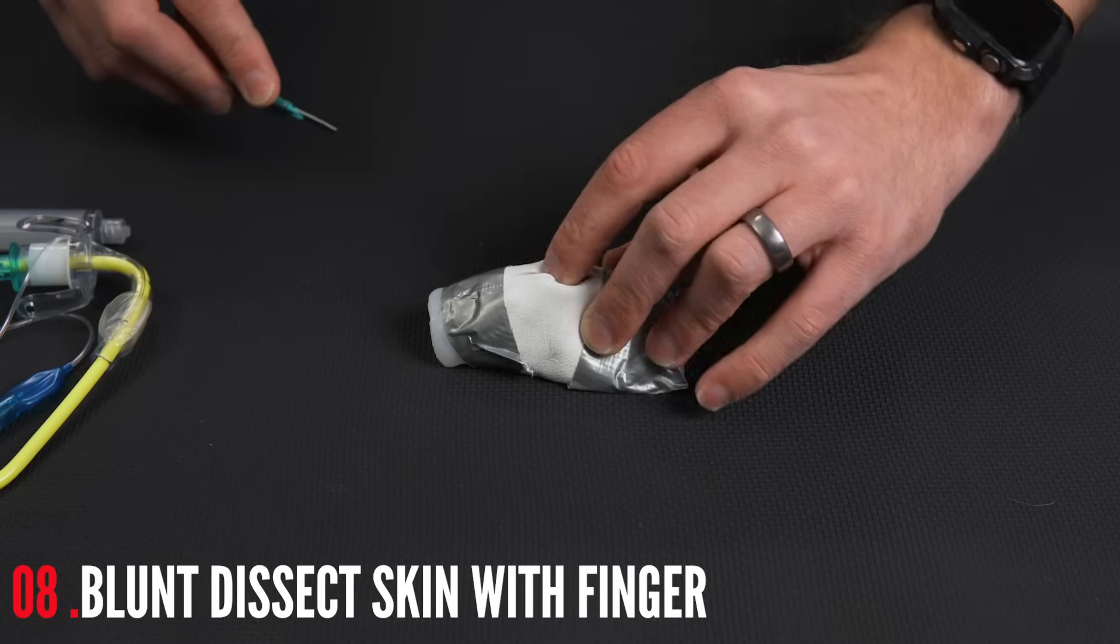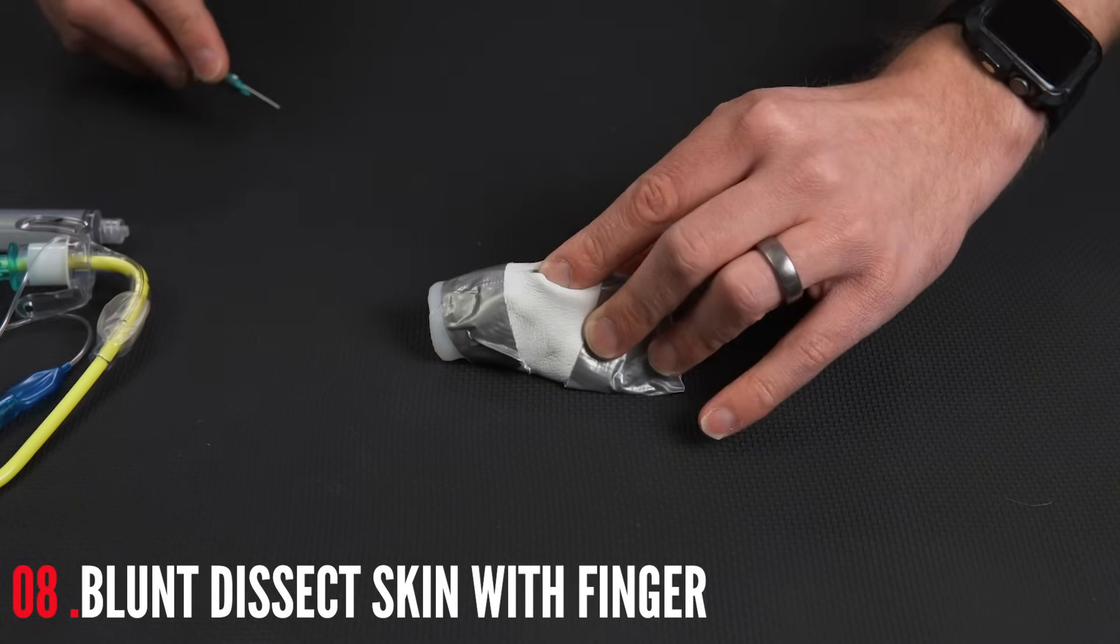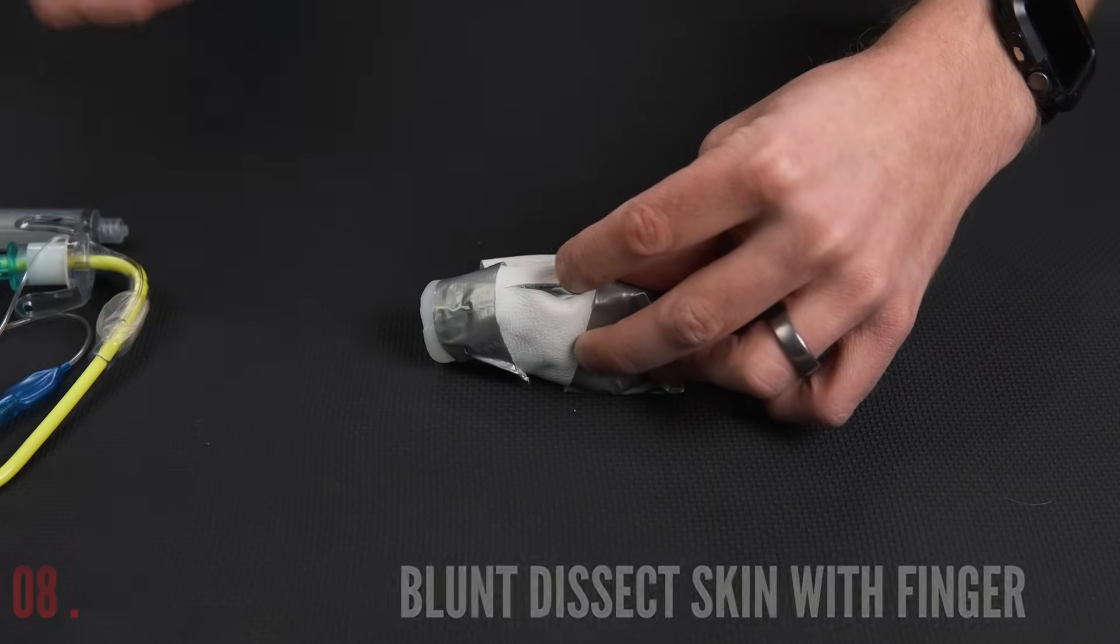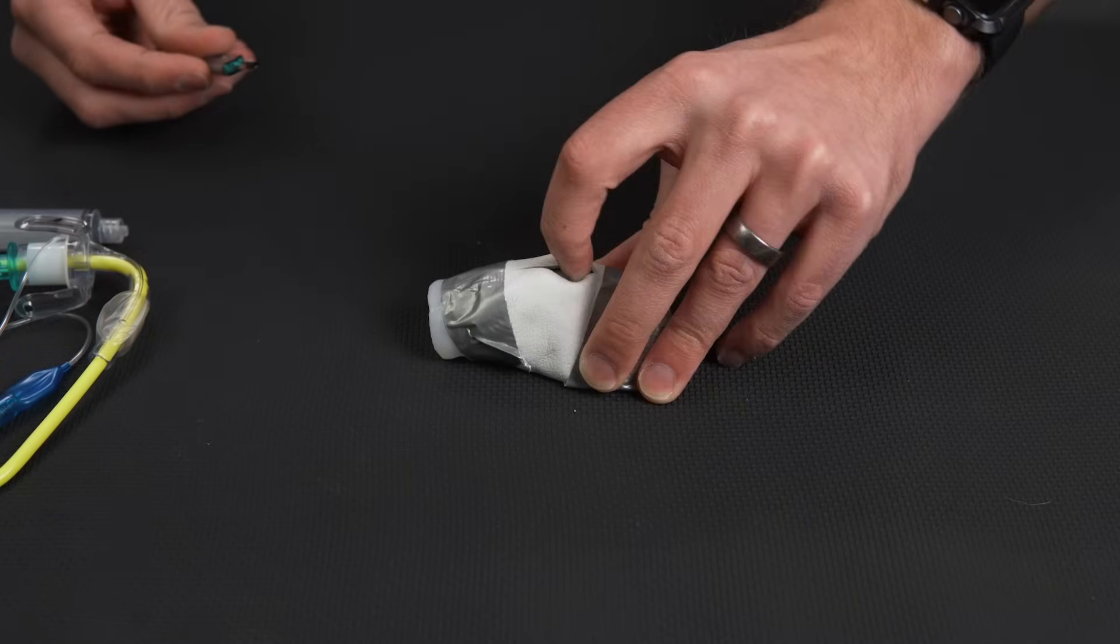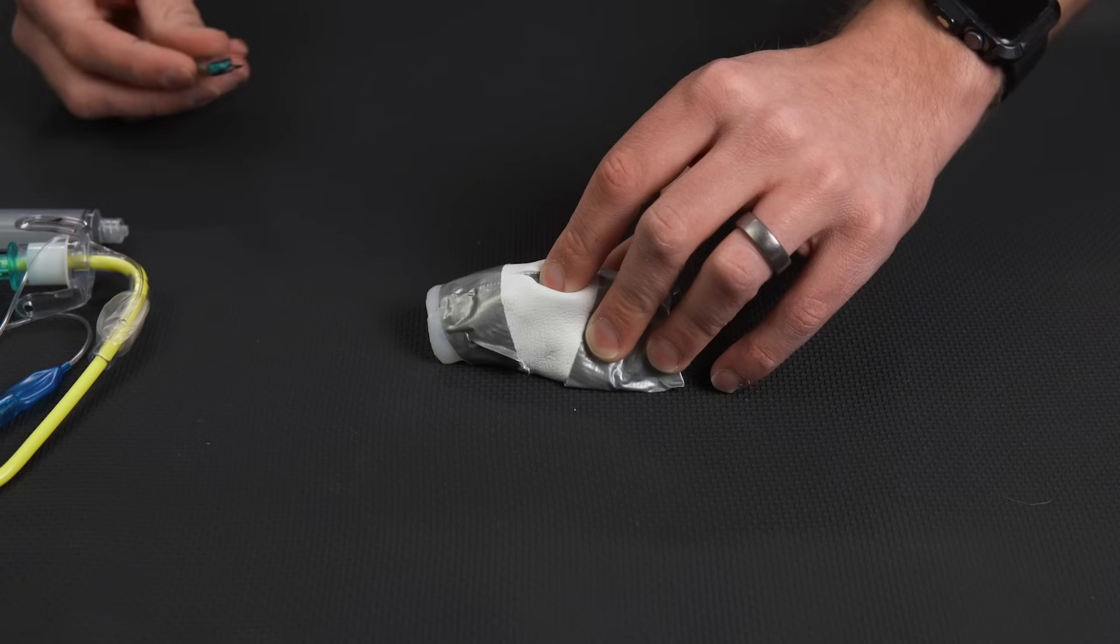I'm going to take my finger and I'm going to blunt dissect with that finger, making sure that I can actually feel the membrane underneath it. If you actually see that there, you can see the quote membrane, the duct tape I have in place. So we've blunt dissected down with that finger and that finger is going to hold that steady.